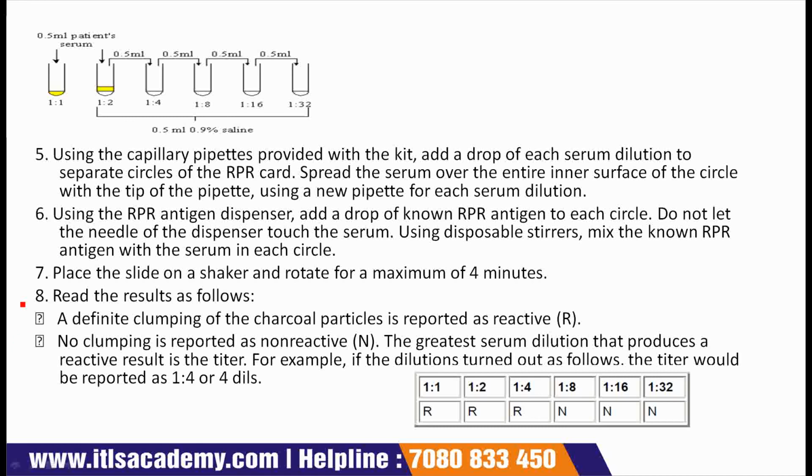Now read the results as follows. A definite clumping of the charcoal particles is reported as reactive or R, and no clumping is reported as non-reactive. The greatest serum dilution that produces a reactive result is the titer.